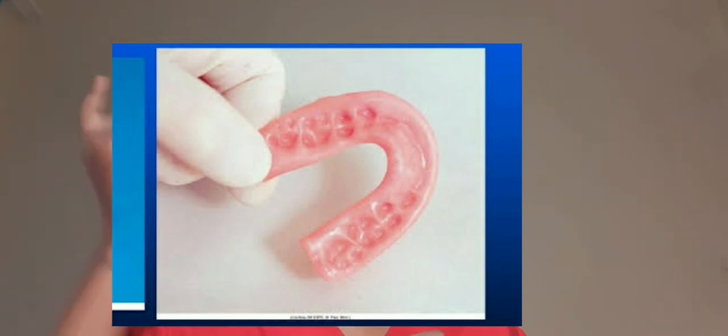They have a standard appearance, and they're normally made out of white cast. I think it's type 3, the lab gypsum, one of the 5 types that we just discussed 2 seconds ago. We normally put them into occlusion using the wax bite registration that we took earlier on in our lecture. They also have standard guidelines on how you trim orthodontic models. I'm not going to go into that because it's quite a long process, but you will do it practically if you haven't done so before. Whatever you're taught, please take it seriously, and that's basically how you trim your models. It'll probably be asked for in your practicals.